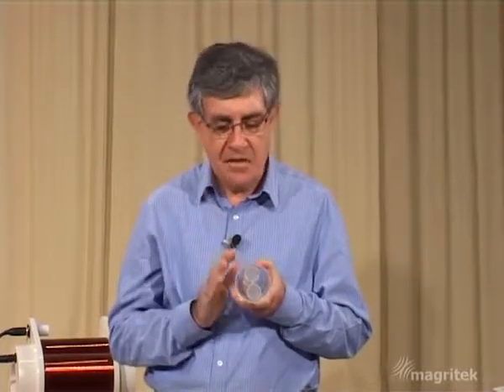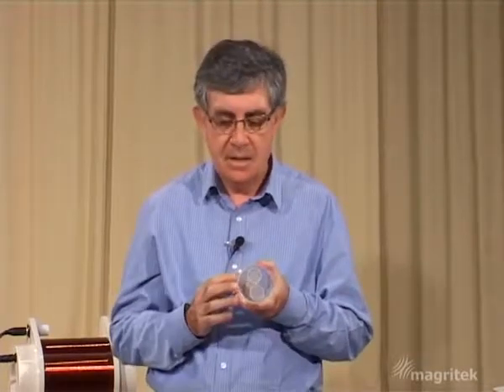Now imagine if we could make that magnetic field vary linearly along the axis where the two tubes are separated. In that case, we'd have a very simple relationship between frequency and position. In fact, our frequency axis would also be a position axis. How could we do that?